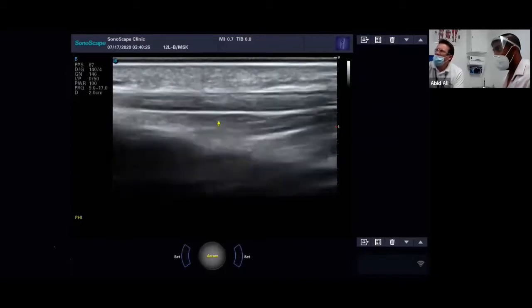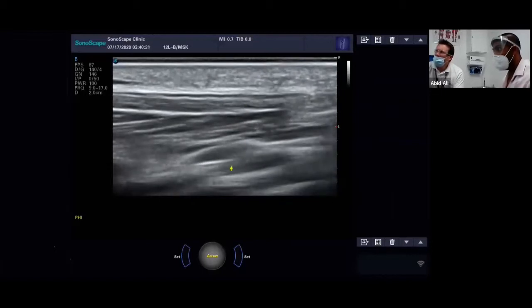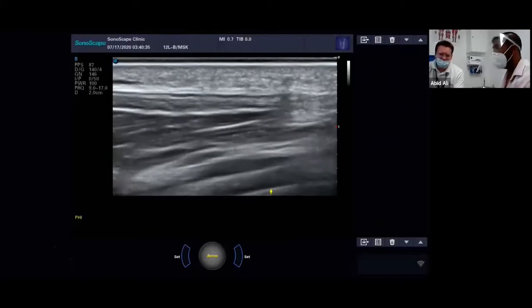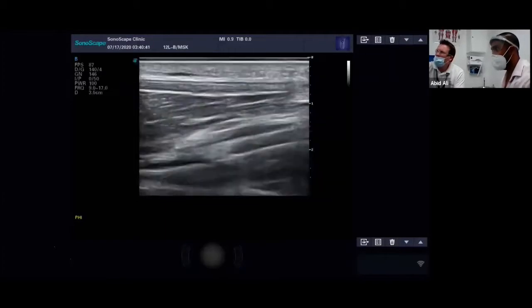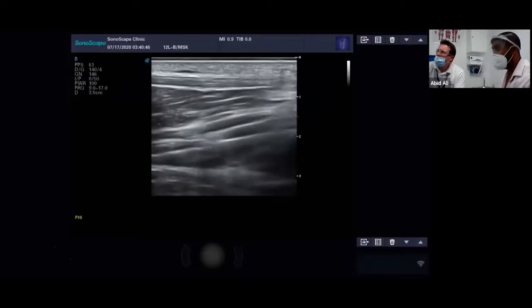You can see the fuzzy shadow of tibia underneath. But interestingly, we're on the uppermost part of the lower third of the shin. I don't think we need to go past that, but if you want, just move your toe again for me, Adrian, let people see the movement of the muscles underneath. And of course, the brilliant thing about ultrasound is you can look at things dynamically.